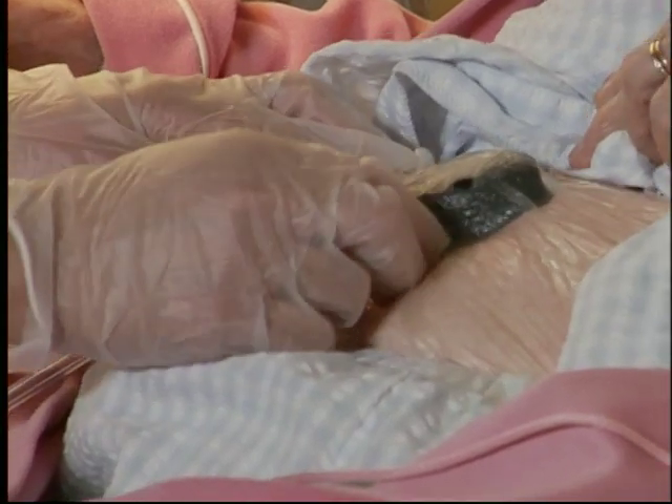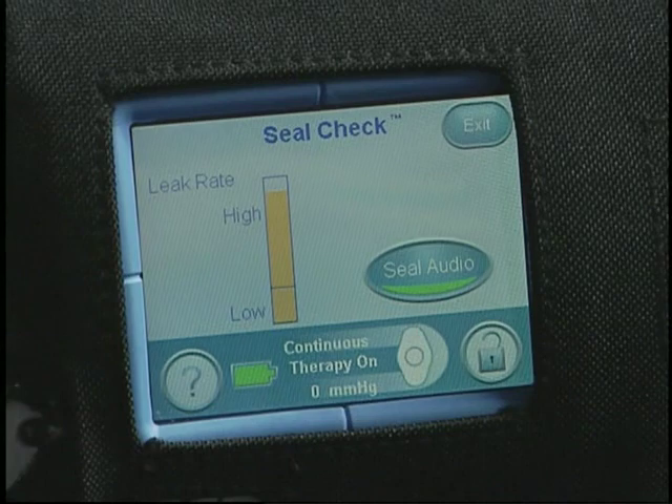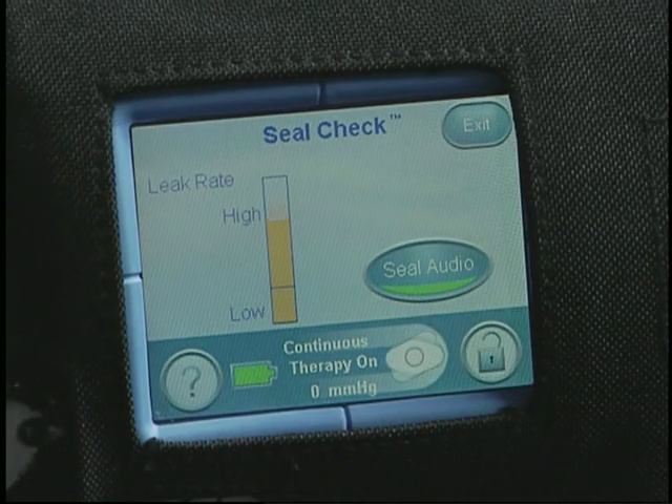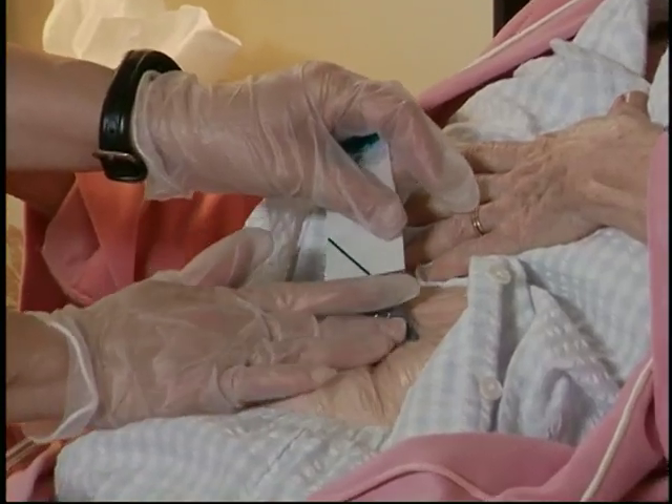While therapy is on, move your hand and fingers slowly over the drape and pad while applying light pressure. When your hand covers the leak, the tone and the bar height will diminish. Add a new piece of drape to repair the leak.